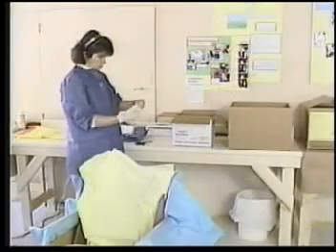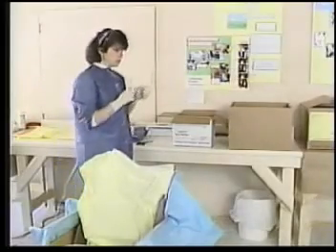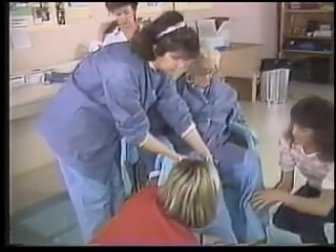When handling the foam-in-place chemicals, take the same precautions you would when handling any potentially hazardous item, such as solvent or hot water. The foam-in-place team, as well as the client, should wear protective clothing to protect them from accidental spills.